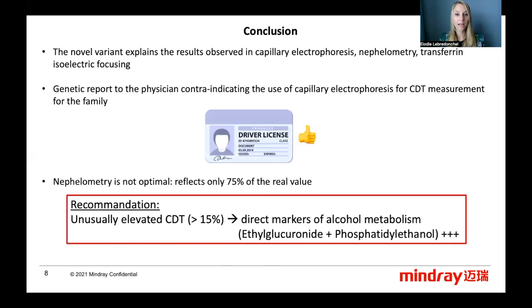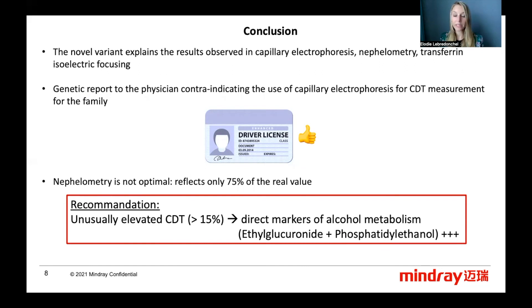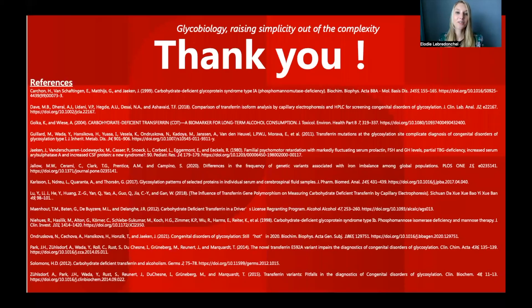The driver's license was given back. However, the immunonephelometric method is not accurate — it only reflects 75% of the real CDT value, because 1 out of 4 glycans is missing. So we recommend, in the case of unusually elevated CDT over 15%, to measure direct markers of alcohol metabolism, such as ethylglucuronide and phosphatidylethanol. Thank you. Glycobiology is raising simplicity out of this complexity.